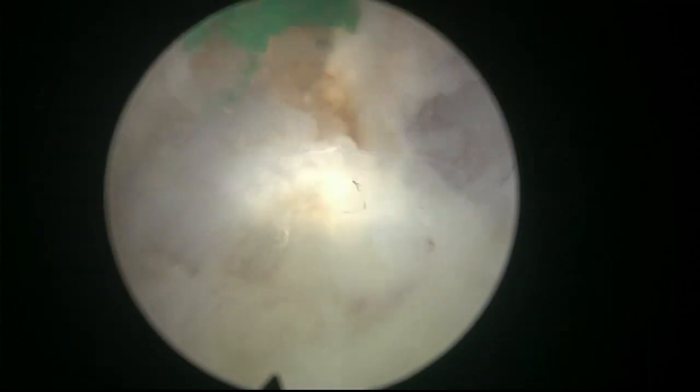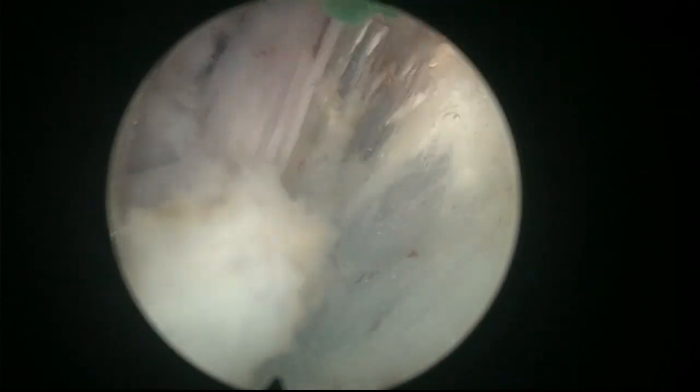See, Moses is very good for hemostasis. Even when there is, let's say, a pumping bleeder, you can usually control it rather easily. And this is one of the advantages over the low-power lasers, I think. You struggle much more to coagulate pumping vessels with low power. Yeah? We have to be careful here because the ureter should be closed.